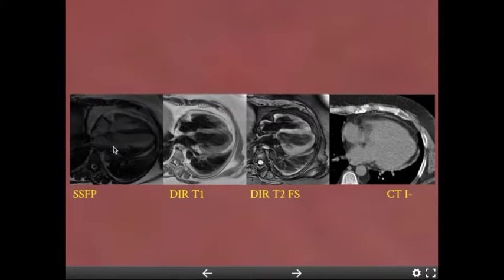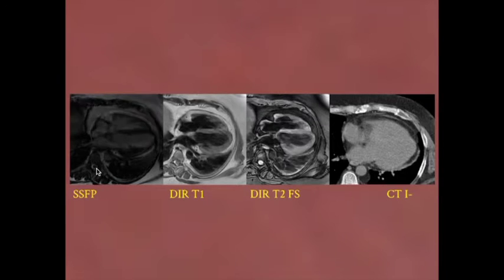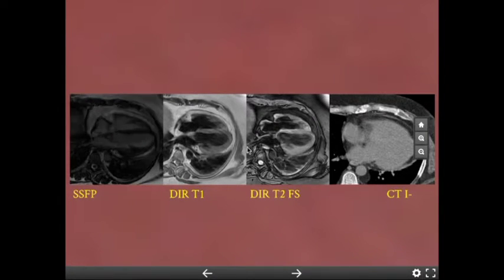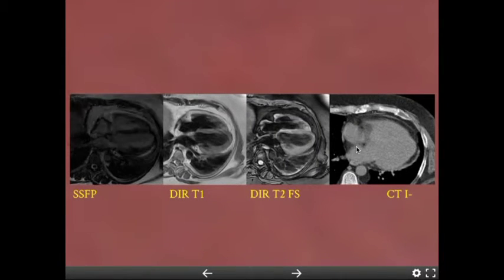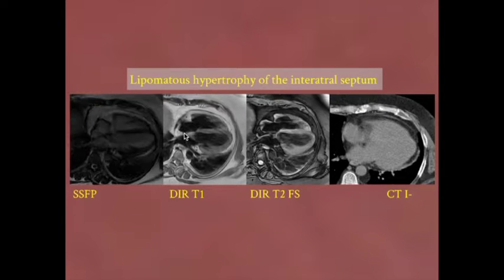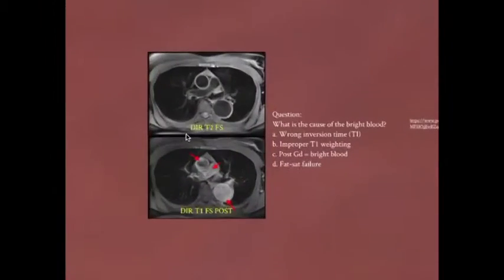Here we have more images: SSFP — with SSFP, CSF is going to be bright due to T2 effects. T1 DIR without fat sat. T2 DIR with fat sat — blood pool is black. Then a CT scan. We're looking at a mass that is bright, saturates with fat on T2, and is dark on CT — fat in the interatrial septum, sparing the fossa ovalis. This is a lipomatous hypertrophy of the interatrial septum.